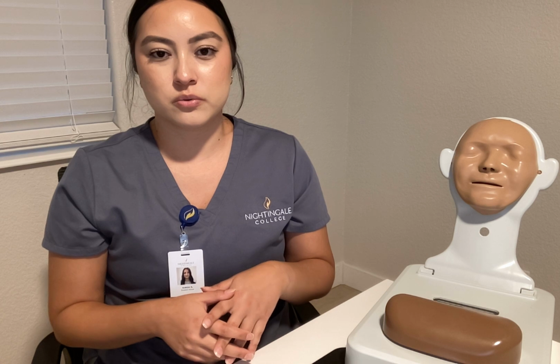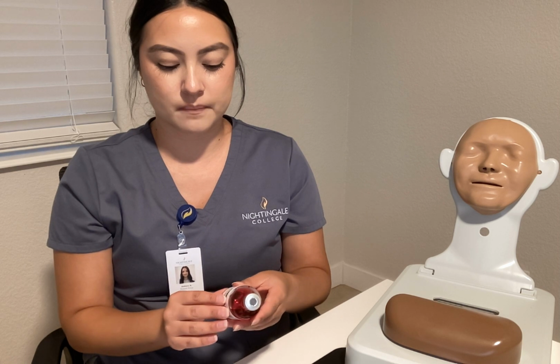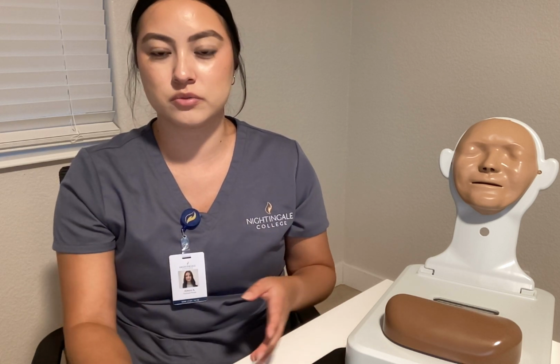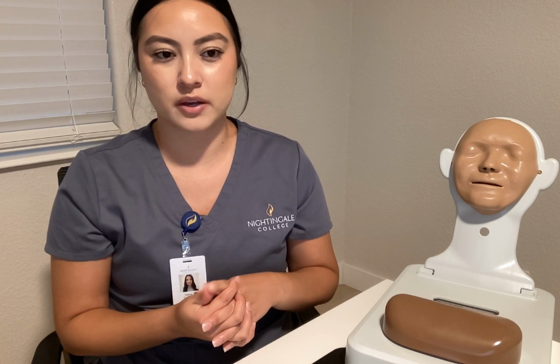Before we're going in, we're going to run through our 6 rights of medication. That's going to be right patient, right drug, right dose, right time, right route, and then documentation. If there was need to do med calculations or convert or anything like that, we would do that before drawing up the medication. In this instance, we do not have to, as our medication typically is already prepared and doesn't need any calculation, and then our orders do not need any med calc. It's just going to be 0.1 milliliters that we're going to be drawing up.